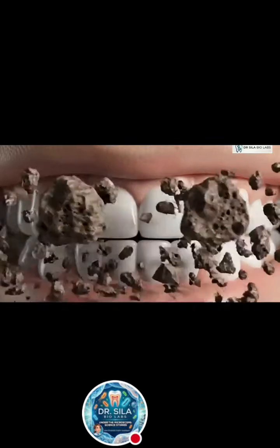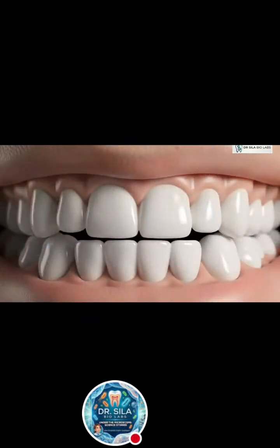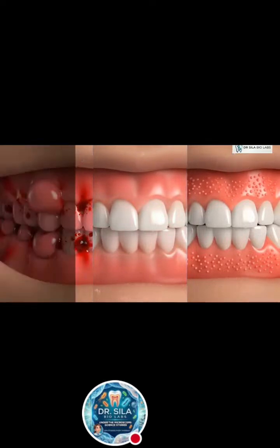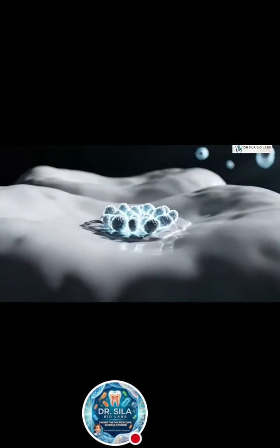In reality, the calculus was filling those spaces and masking the true anatomy. Gums become healthier, bleeding decreases, and the risk of disease progression is reduced. Most importantly, scaling helps preserve the supporting structures that keep teeth functional for years to come. In the next section, we'll learn how to prevent plaque and calculus from returning.